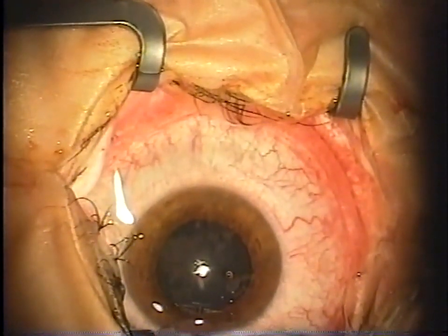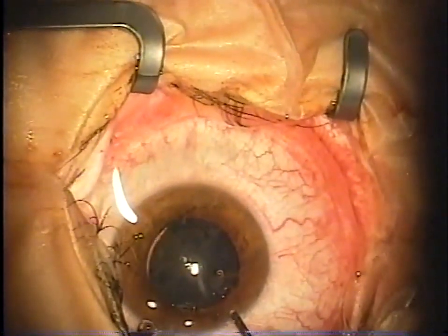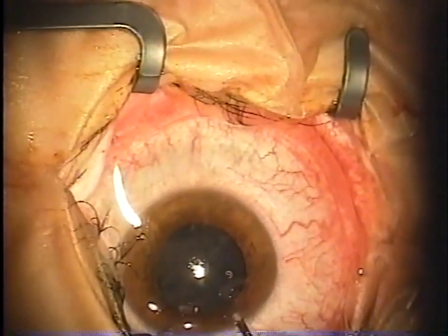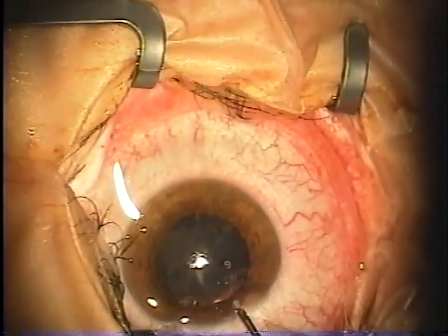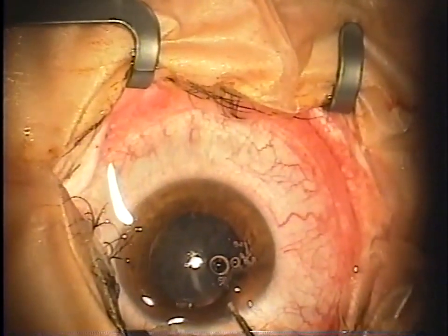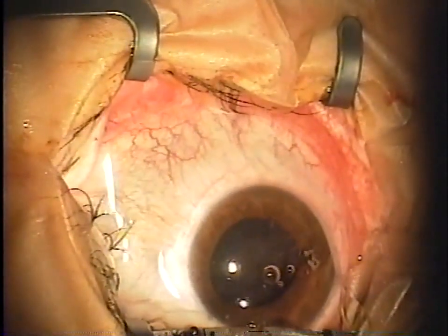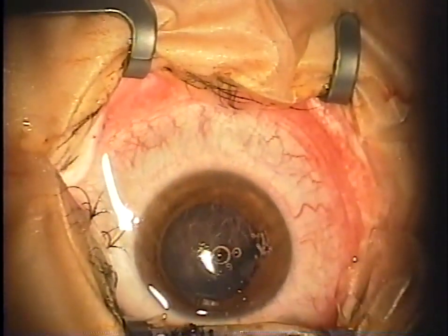Next, you want to instill some OcuCoat into the anterior chamber. The Visian ICL is only compatible with OcuCoat. The other viscoelastics can cause deposits on the lens, so OcuCoat is the viscoelastic of choice. Just a small amount here to firm up the eye to make my main incision easier to perform.